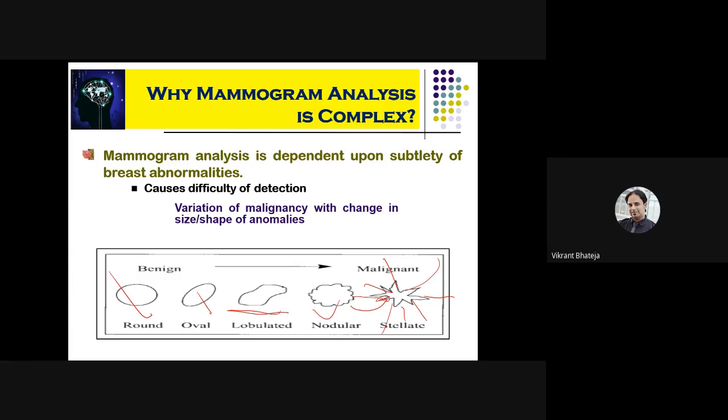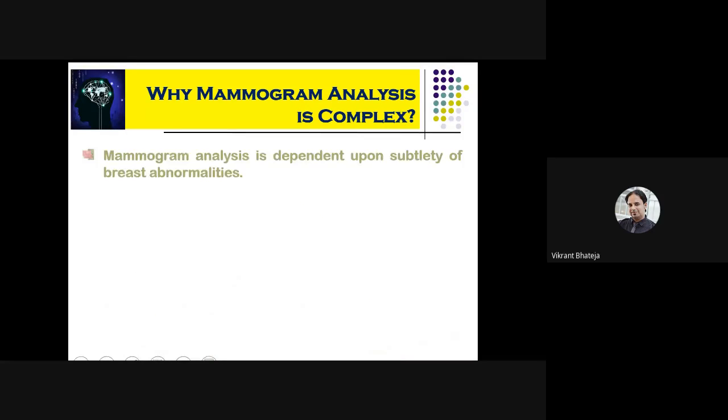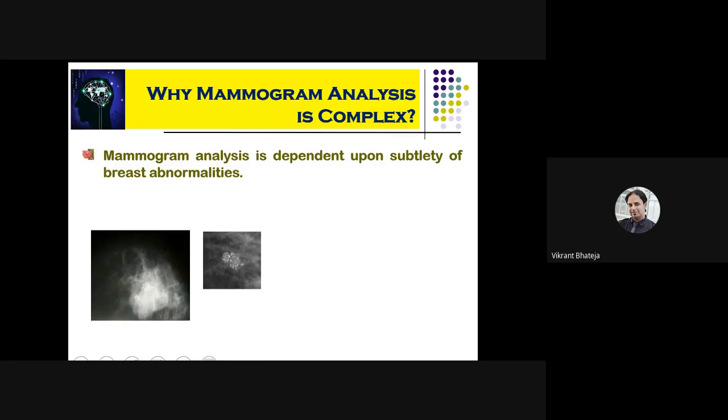So if we are trying to do a shape analysis or classification of mammograms on the basis of shapes, right? Probably there are these five types of shape cases for such kinds of problems, where you can see that the first two cases are generally classified as the benign ones. These two cases are probably malignant, but again there is a third category, which needs further investigation. Now, this was what we have learned about the different types of tumorous regions or mammographic masses.